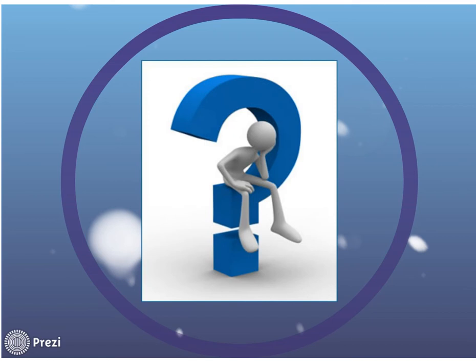Work some into your daily practice, and especially on things like cysto cases, eye cases sometimes work. Simple kinds of cases. You only have to actually mask them for like 30 minutes for it to count. So you could start with a mask and then slip an LMA in. I know this trick. But if you try to mask a case that's like 2 hours long, I'm telling you.